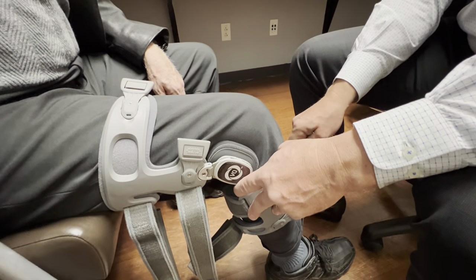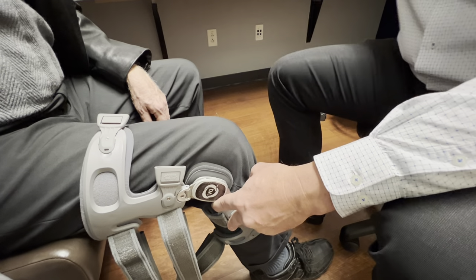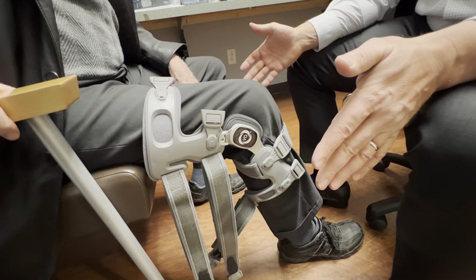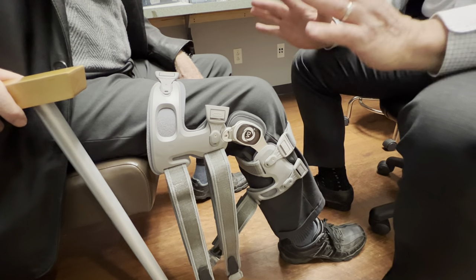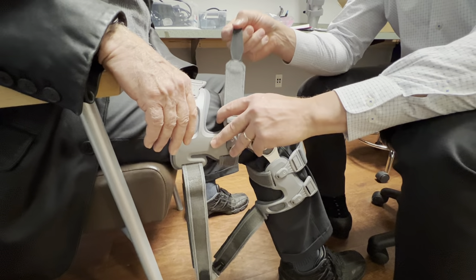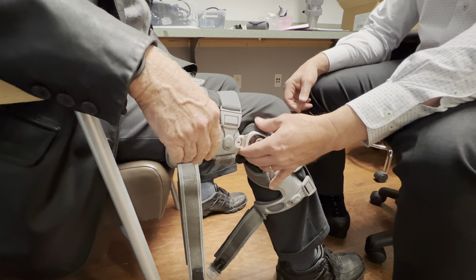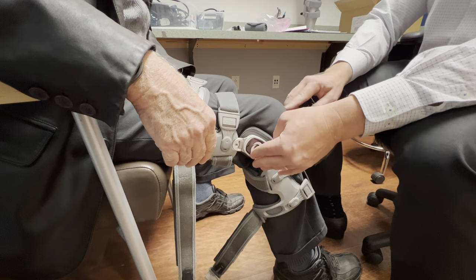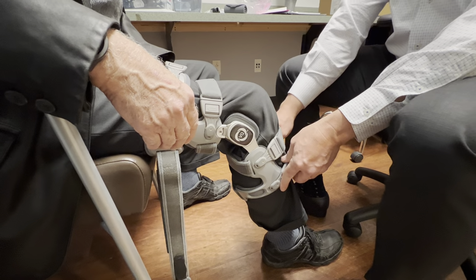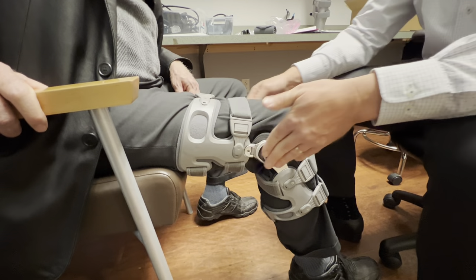If you put it on too low you don't really grab the calf — the calf is what's preventing the brace from sliding down the leg, along with the suspension sleeve we're going to give you. Once that first strap is on, the brace will literally sit on your knee without any other straps. Then surround the knee with the next one, rechecking the hinge between each strap to make sure it's still in the perfect place. Then put on the bottom one, snug it up, put on the top one and snug it up.